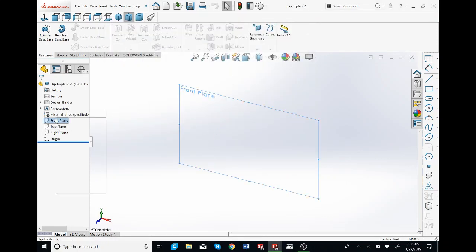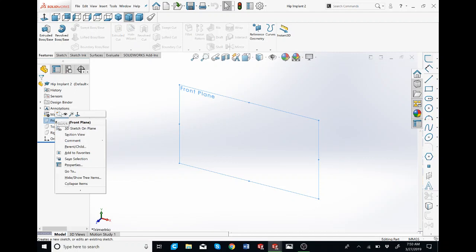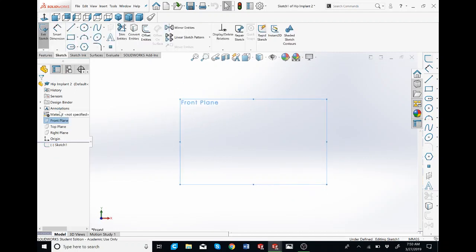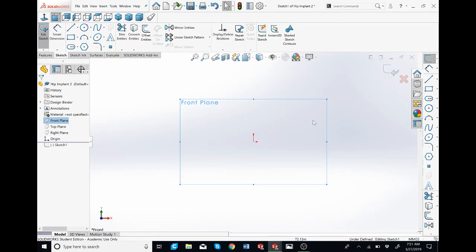Now I'm going to right click the front plane and click on sketch. You want to make sure that you're in a regular sketch and not a 3D sketch. You can tell right over here, it will say 3D. If it is 3D, exit out of the sketch and then delete it and try it again.